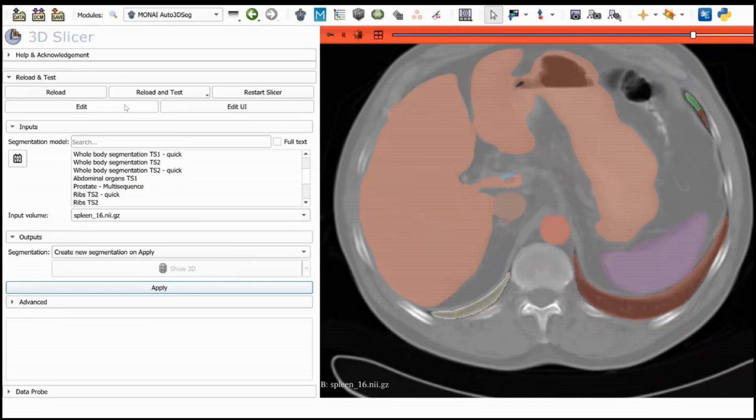Yes, please. On architecture as well, in training in the background, is it a UNet or a different format? Yeah, very good question. So MONAI Label is under the umbrella of MONAI. So everything that you have in MONAI or everything that you have in PyTorch, you can use in MONAI Label. For these models, we use SegResNet mostly, but there is another model, the DiNTS, that uses the UNet, transformer-based UNet. But to be honest, you can use any network, so it's very easy to change it.